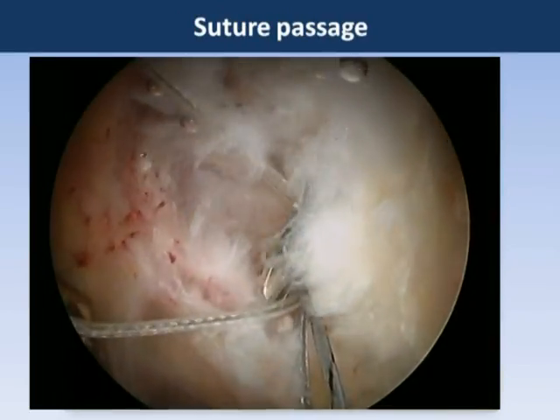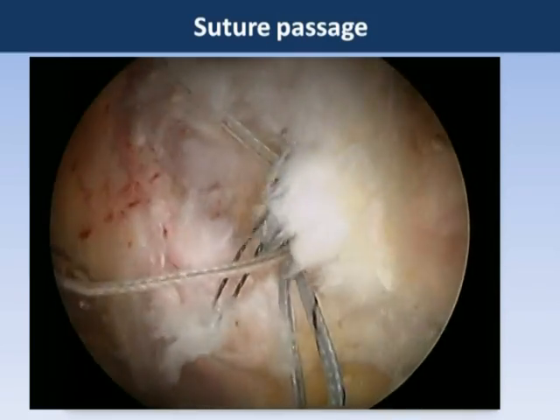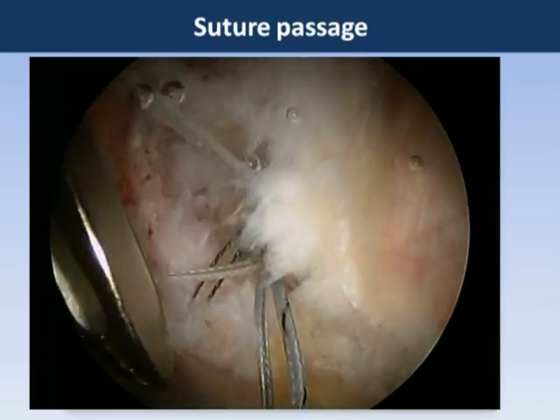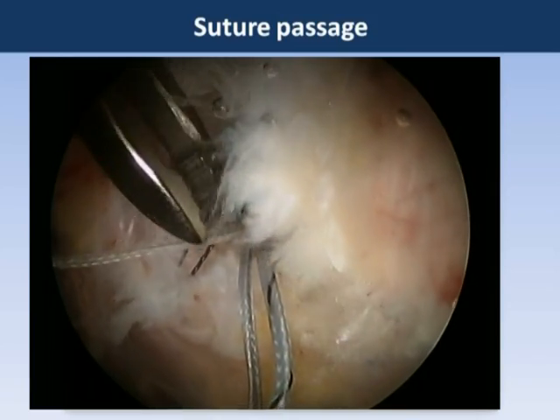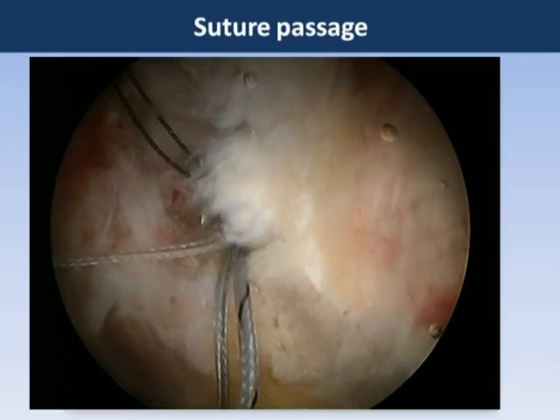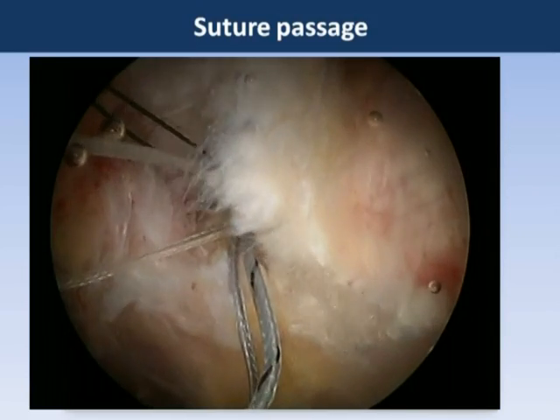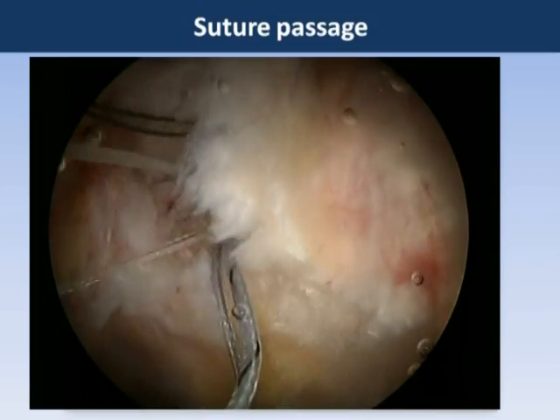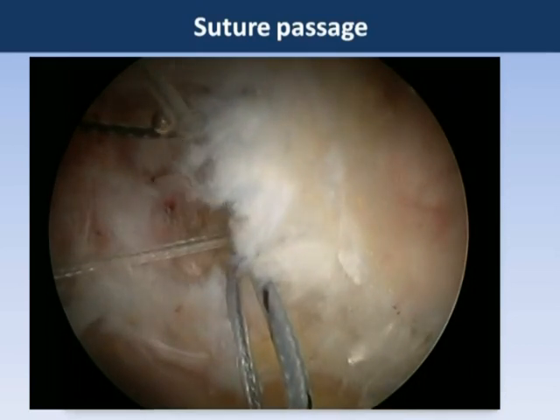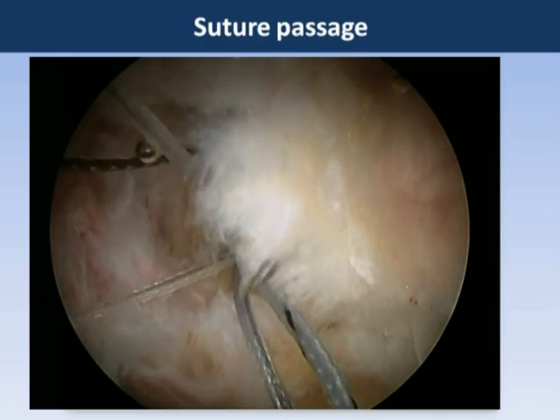We have now placed our anchor and will use a suture lasso shuttle device to pass the sutures through the tendon. Our goal is a side-to-side mattress stitch repair, so we intend to pass one limb of suture from each suture through the more anterior limb of the tendon and one limb from each suture through the more posterior limb of the tendon. When these are subsequently tied down outside of the tendon, this will accomplish a side-to-side repair and re-approximation of the good tendinous fibers to the bleeding bed of bone that we have created.